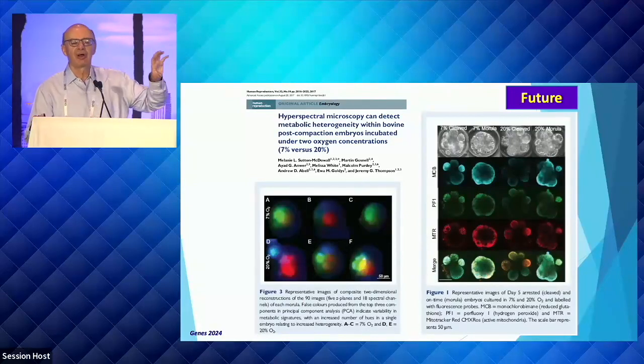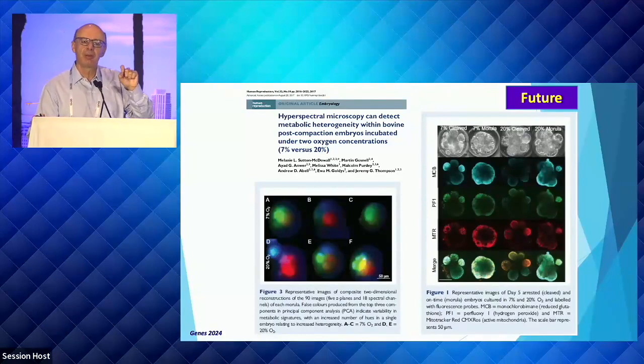One thing I failed to mention is that when we're measuring with FLIM, NADPH and FAD autofluoresce, so we're not adding any fluorescence tags or anything to these embryos. But there are many things in our bodies, proteins and other factors, that autofluoresce and are excited when you image them with a laser.